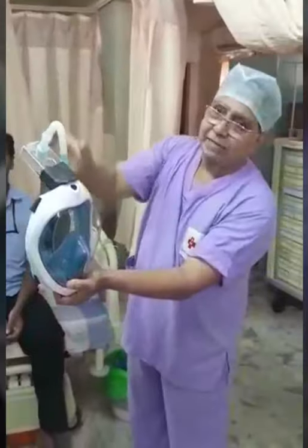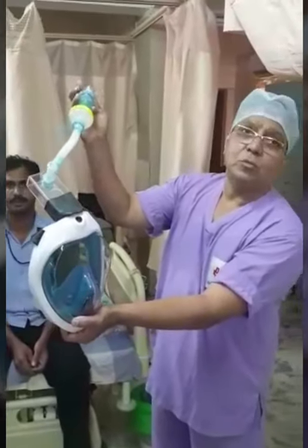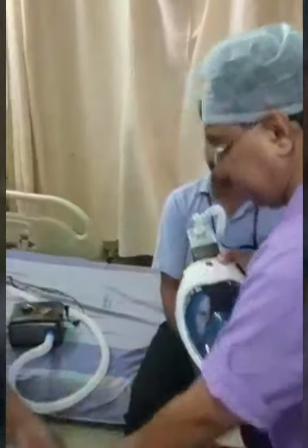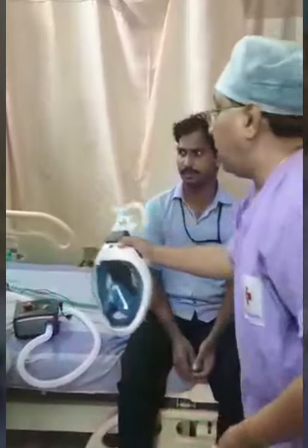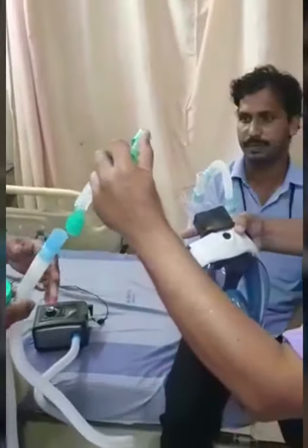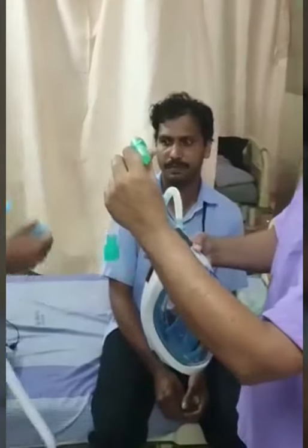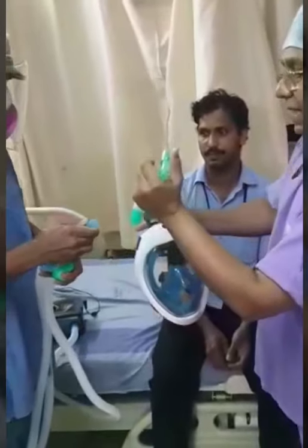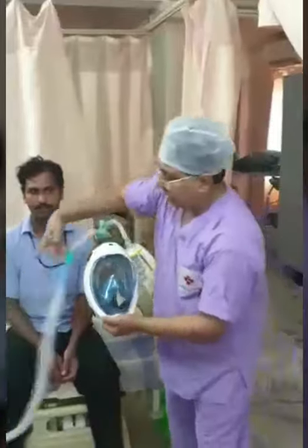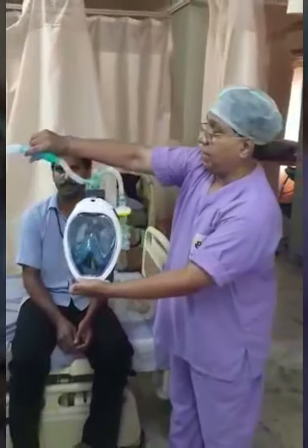The outlet is connected to a catheter mount, again connected to a viral filter and connected to a mechanical PEEP valve for you to adjust the PEEP value to the patient's comfort level. The other port is connected to a high flow oxygen device. This is an ordinary BiPAP/CPAP machine — a Philips Respironics — and we can attach the connector and the catheter mount. It is fixed to the snorkeling mask, and this is how the patient gets oxygenated using two ports.